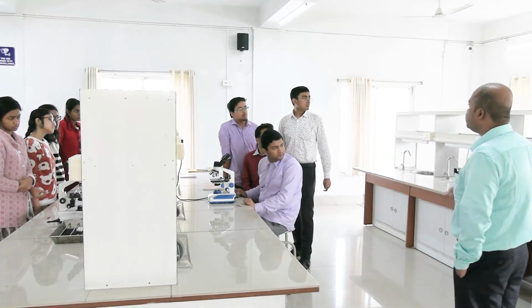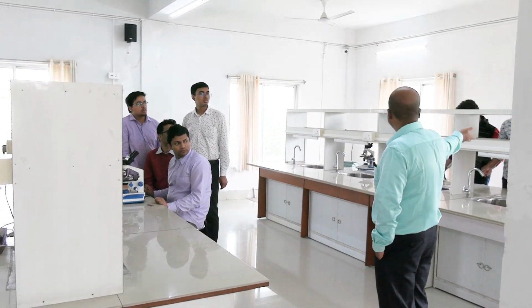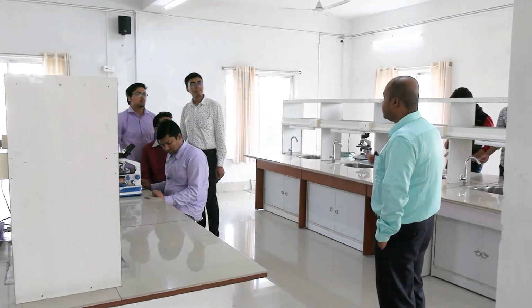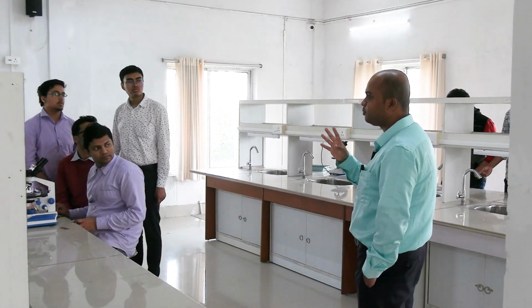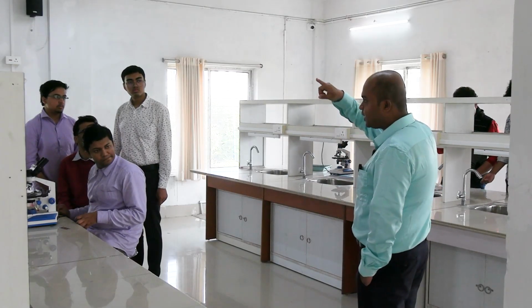He just mentioned it, and then I remembered: never write it as plus or minus. This is a very common mistake. One of the students just mentioned plus minus. So what may happen when you become professionals, using a sign like minus? Just think about it. A minus sign may be easily converted to a plus sign.